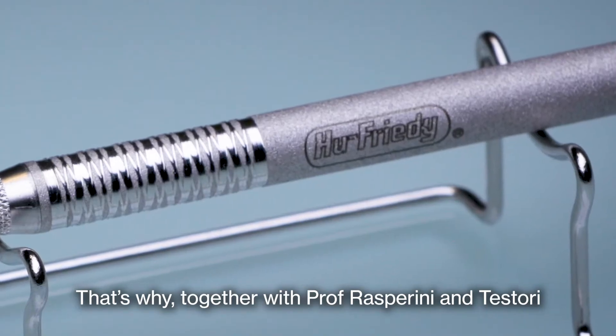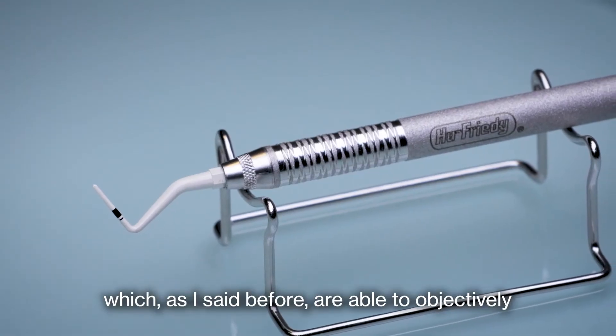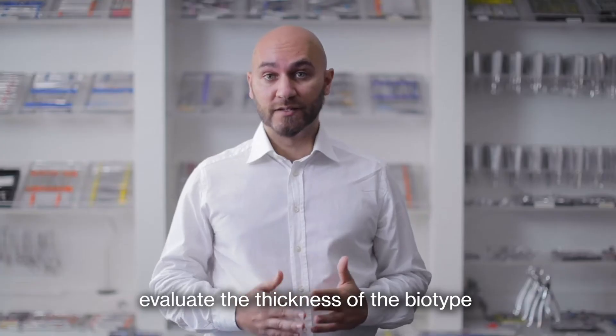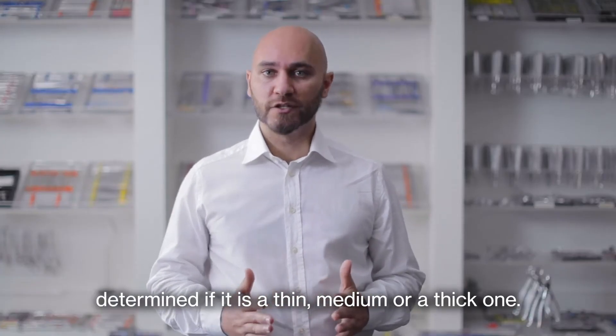That's why together with Professor Asperini and Testori we developed the biotype probes, which are able to objectively evaluate the thickness of the biotype and determine if it is a thin, medium, or thick one.